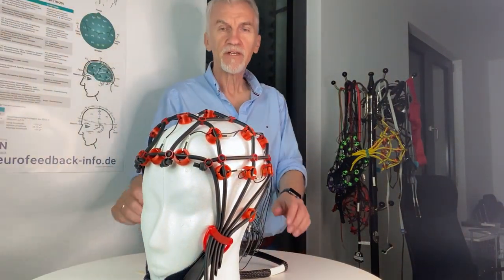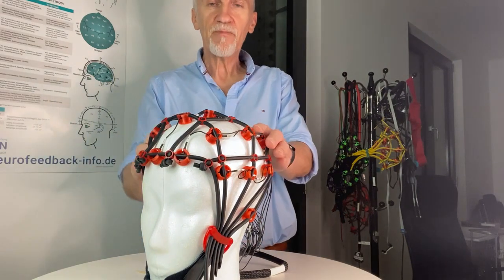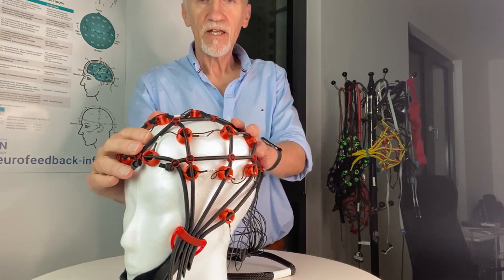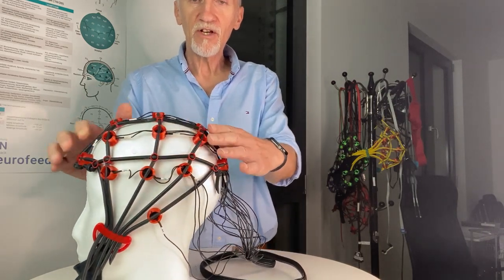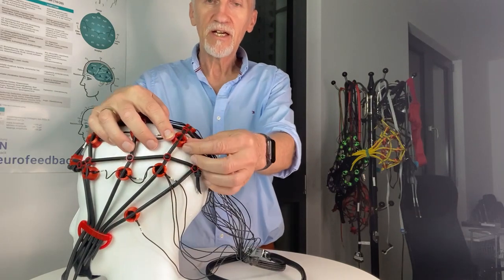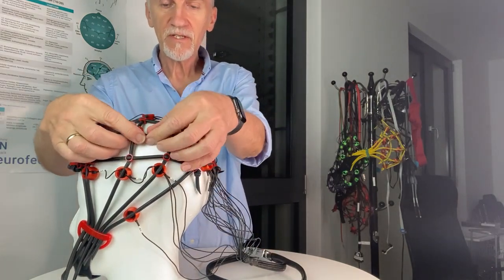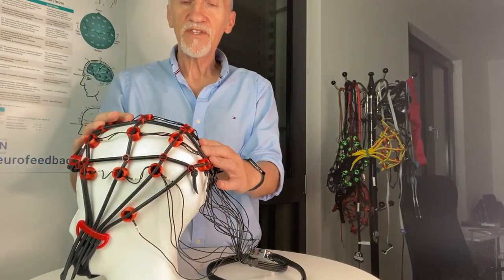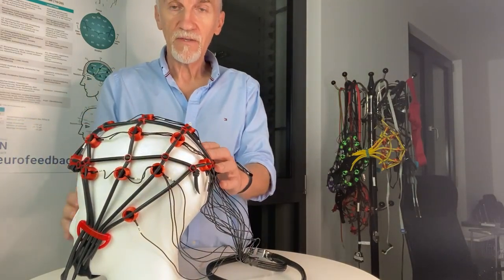If you look at the free cap, you don't see a cap — it's actually more a net. Attached on the net there are electrodes, or better said, electrode holders. These holders are placed along the electrode net.